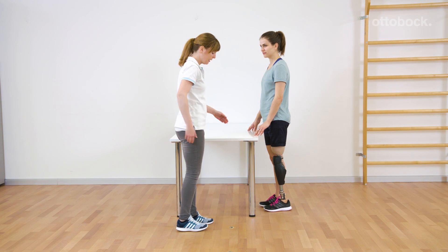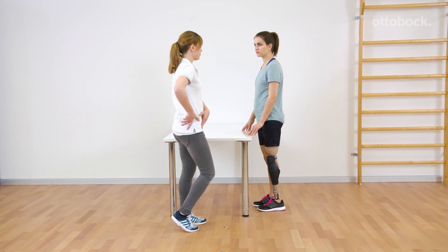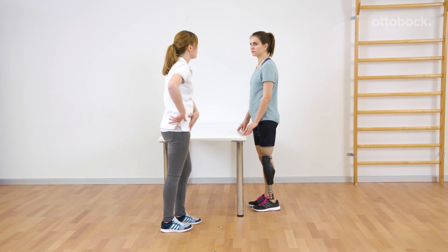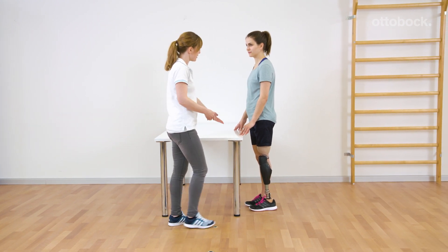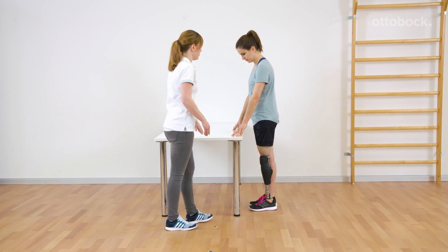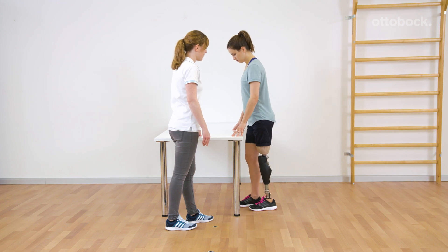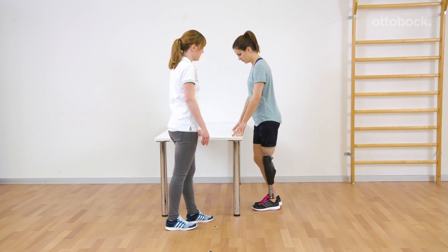Franziska explains circumstances when the knee joint detects stance release. Besides walking, this can also occur in other daily life situations if the criteria for stance release are fulfilled. Franziska encourages Reka to consciously trigger stance release. She learns when the knee joint releases into swing phase.